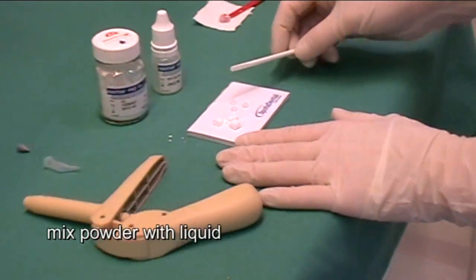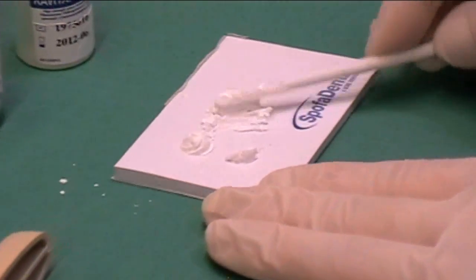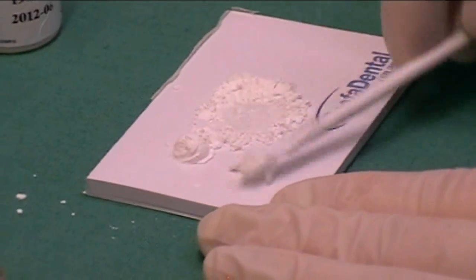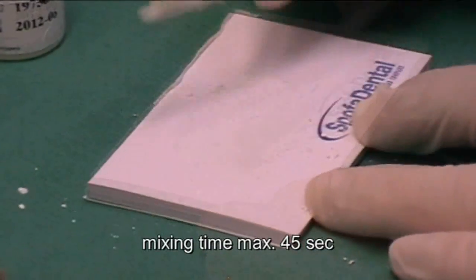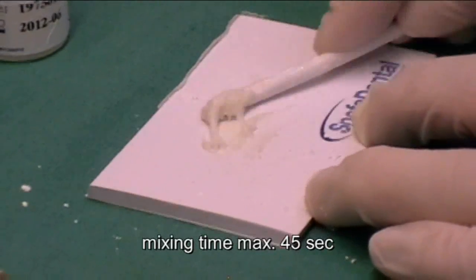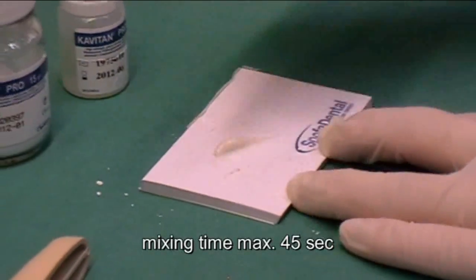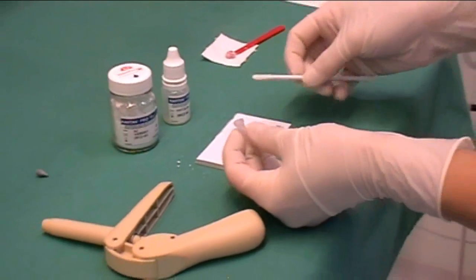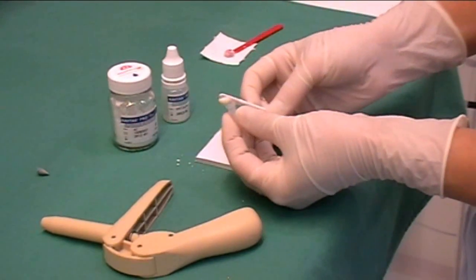Mix the powder with the liquid. Mixing time is 45 seconds at the maximum. Apply with a suitable instrument into the tube.